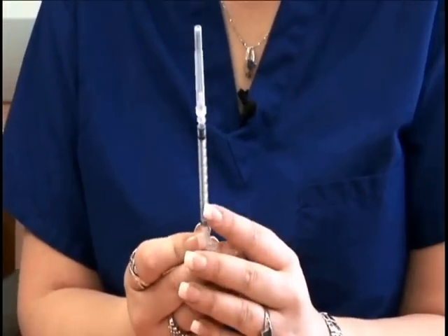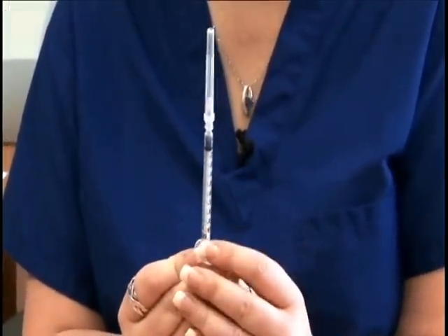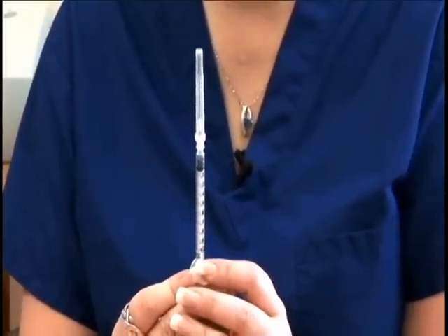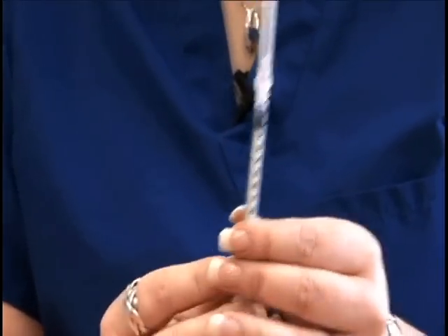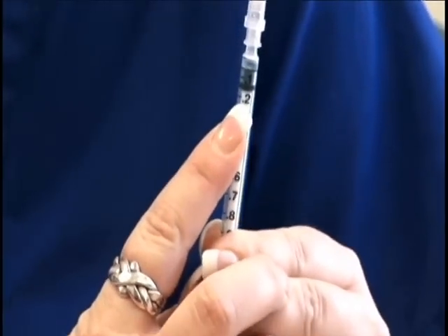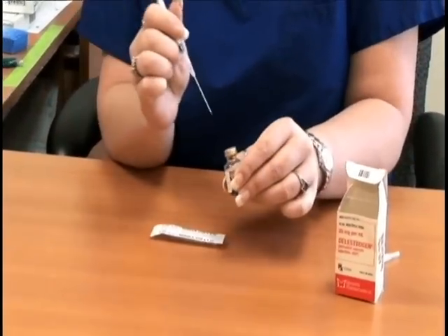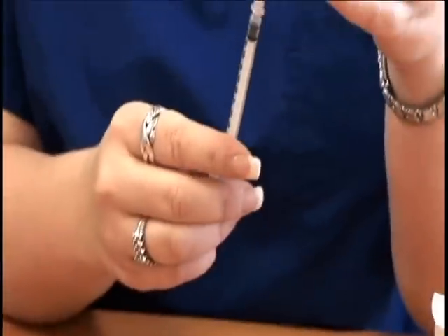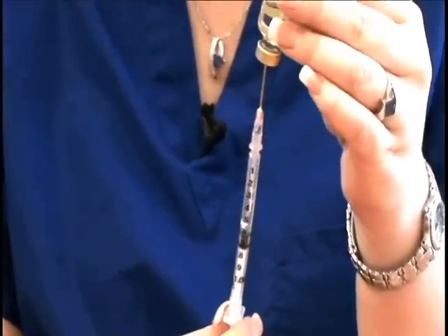As you can see, the 1 ml syringe lists the medication amounts as 0.1, 0.2, all the way up to 1.0. According to your calendar, you need to take 0.2 mls, so you're going to pull it up until it comes to the 0.2 mark. Remove the cap to the syringe, inject it into the vial of liquid, turn it upside down, and then pull back on the plunger of the syringe.